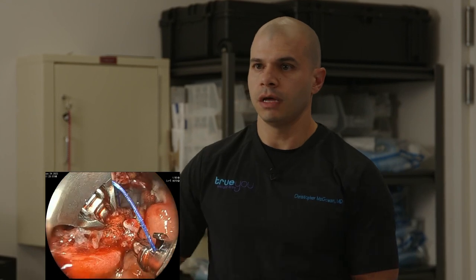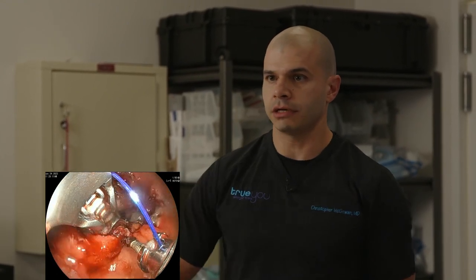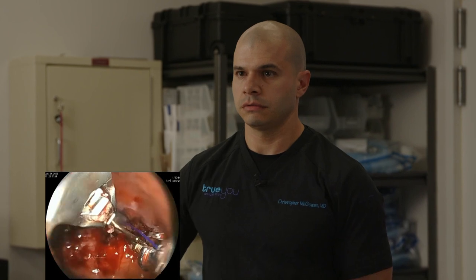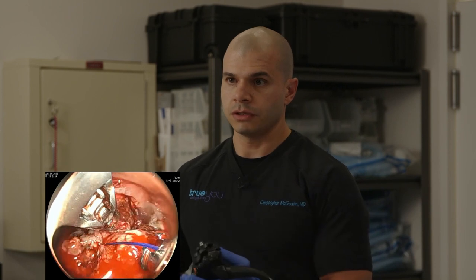So I'm being mindful of my sutures. I am kind of wrapped around the tower here, so I'm going to unwind that. There we go. Okay, so I've come all the way around and beyond a bit. So we are ready at this point to tighten this. Now, I could pull this tight, as you can see, and completely close it shut. We don't want to do that. That would not be pleasant.